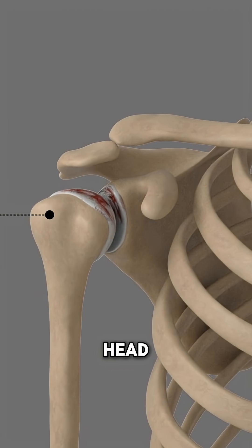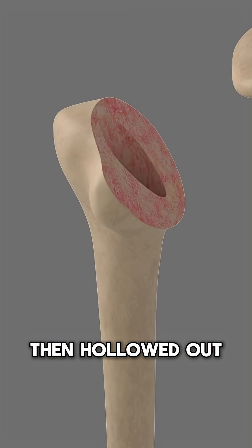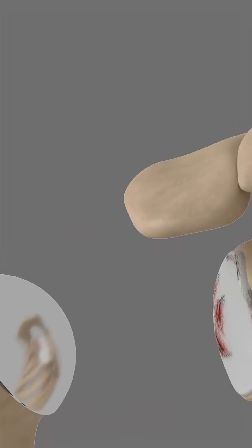The arthritic humeral head — the upper arm bone — is removed carefully. The humerus is then hollowed out and filled with cement. A metal ball with a stem is gently pressed to fit in the humerus.